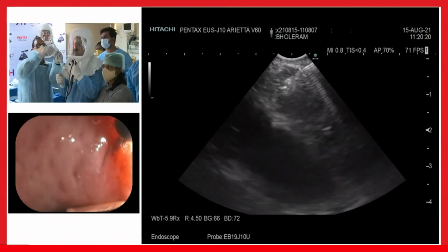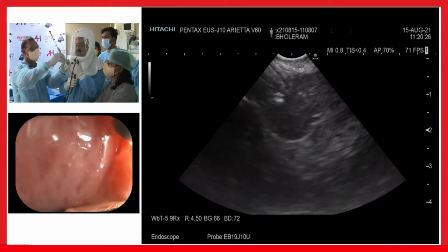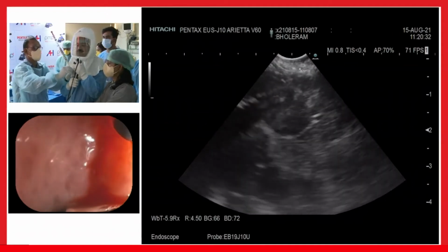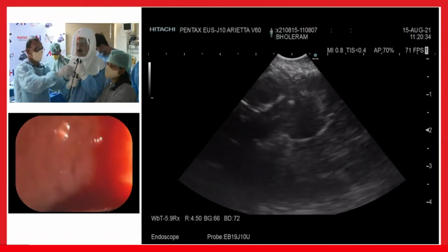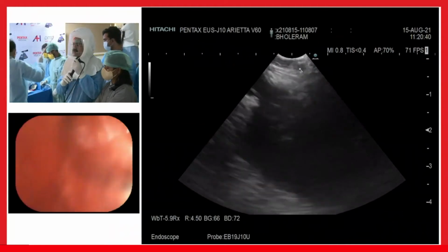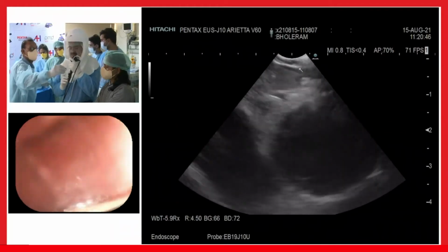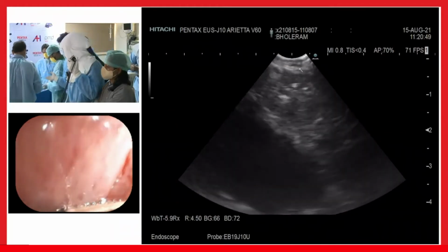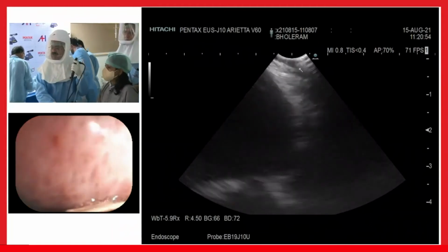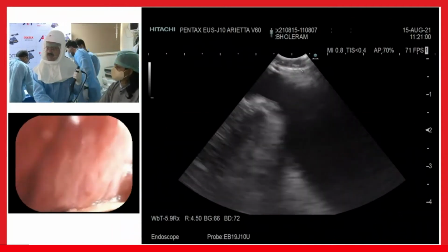Okay. Let's take out. So we have taken from the station 7 lymph node, this FNAC. Small bleeding is expected from these FNACs. Yes, very small. These are all acceptable. And take out one more if there is anything. So this is station 7, and you can see the left atrium here. Previously, you have seen it very beautifully.